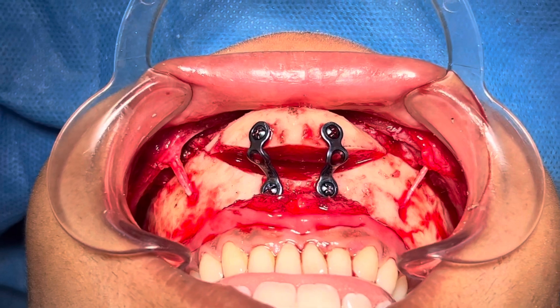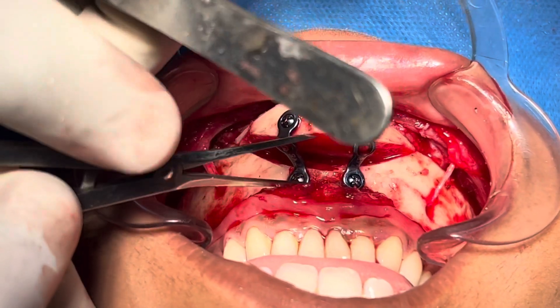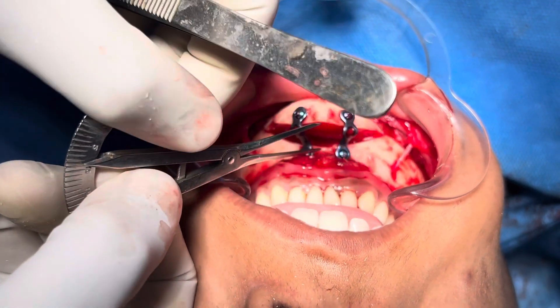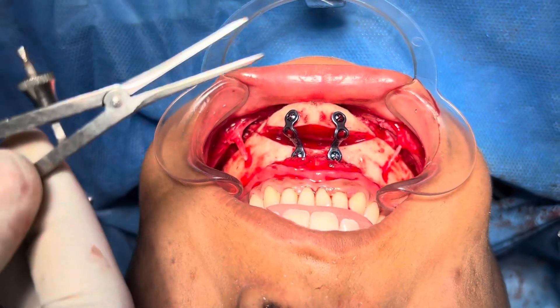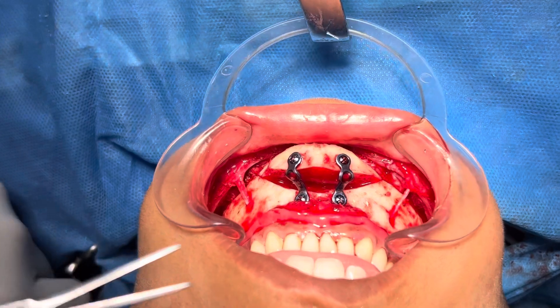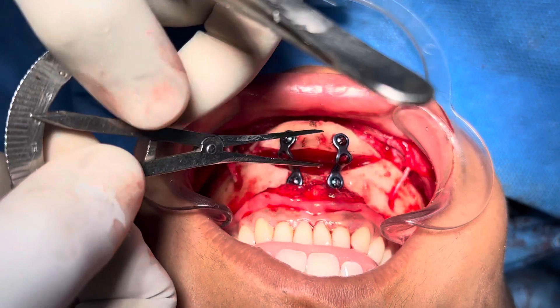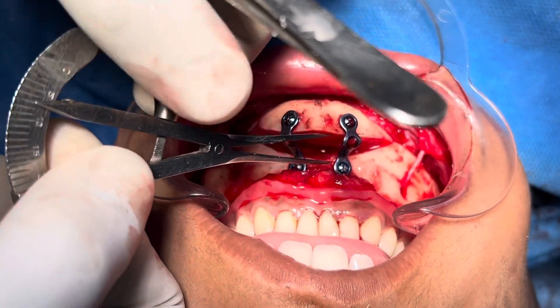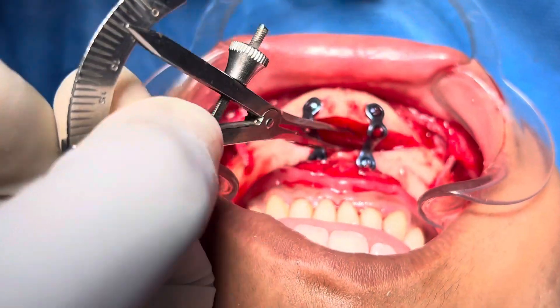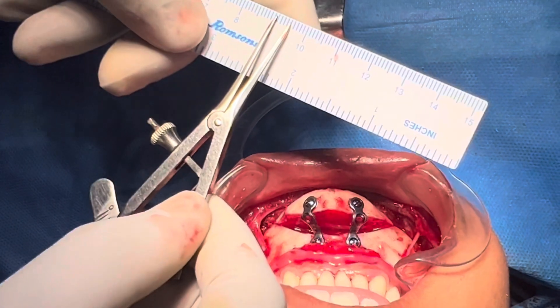We've finished the chin augmentation and chin sculpting, as well as jaw sculpting. I'm going to show you the amount of movement we've achieved. This translates to about 9mm in the horizontal dimension. I also have to check the cap — it should be about 4 to 5mm. So that was our plan, and yes, it's between 4 and 5.